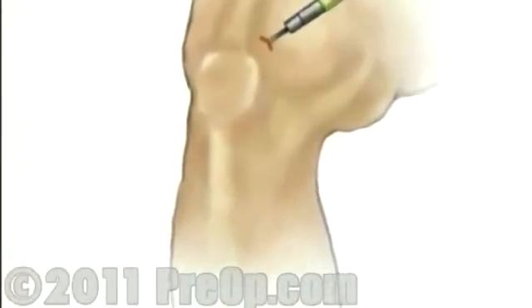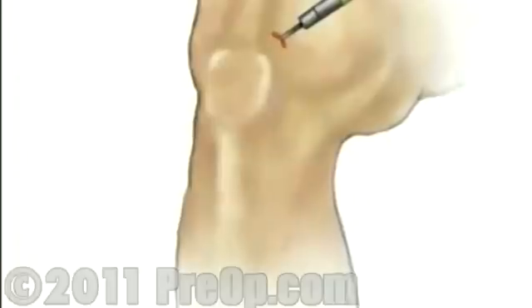The anesthesiologist will begin to numb the lower body by injecting a drug into the small of your back. Before your doctor can insert the arthroscope, the surgical team will inject a clear fluid into the joint. This fluid will inflate the interior space and will help your doctor by providing an unobstructed view.